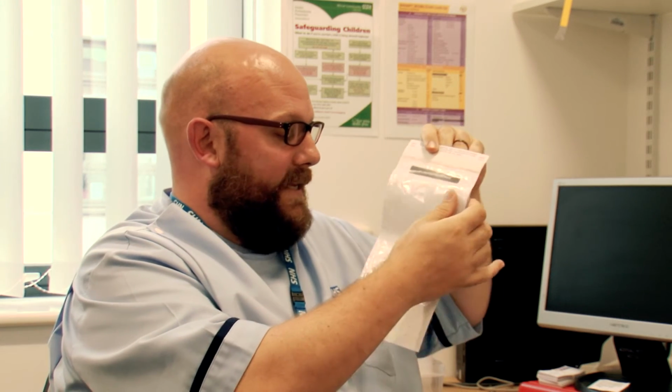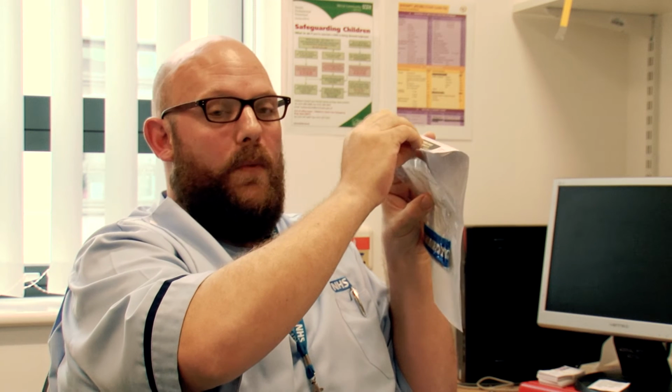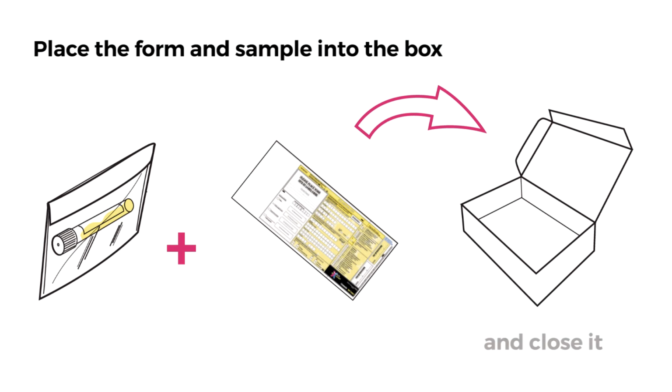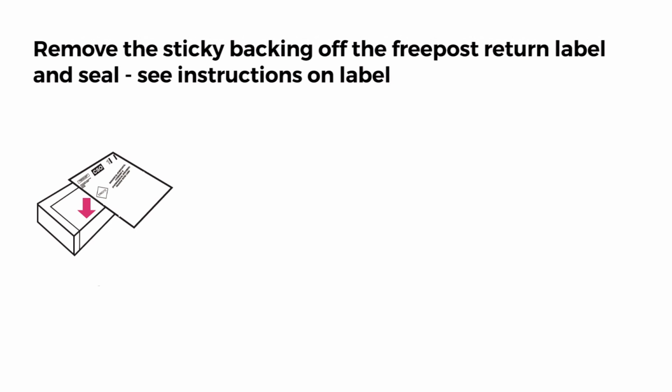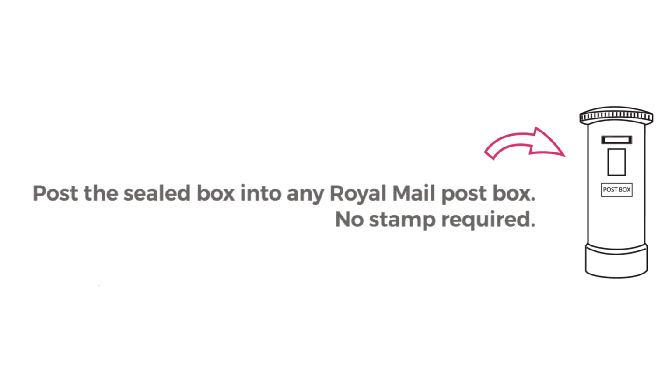So, the sample now is in the pack with the absorbent material. This goes inside here, and then there's a little tab here that we peel off and we close. So that's how easy the chlamydia and gonorrhea postal kits are.